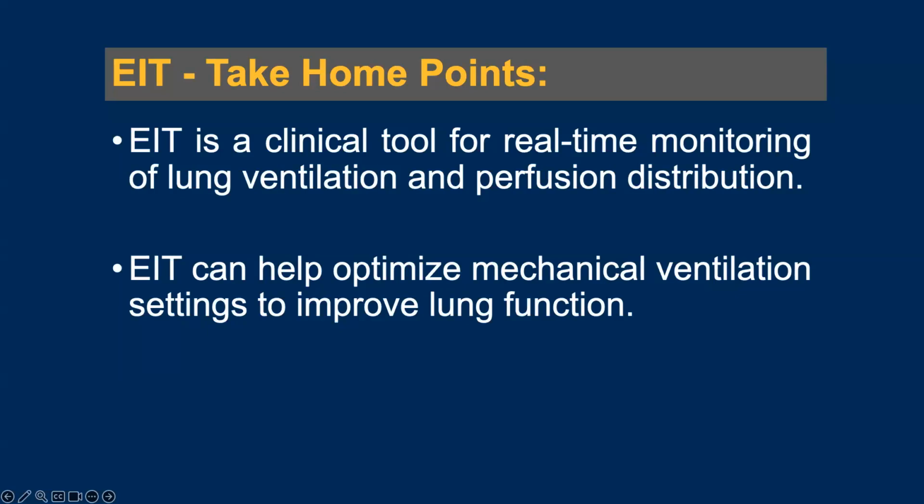And we can also keep on monitoring the effect of respiratory interventions, such as recruitment maneuvers, suctioning, body positioning therapies, stuff like that. And we can definitely use EIT to optimize mechanical ventilation and may improve outcomes, as the recent meta-analysis suggests.